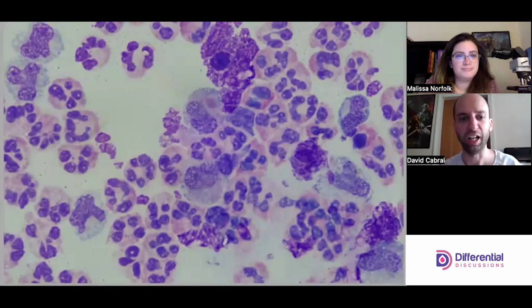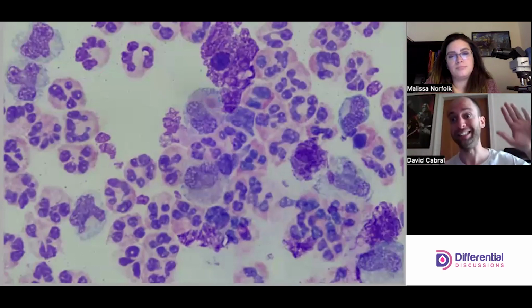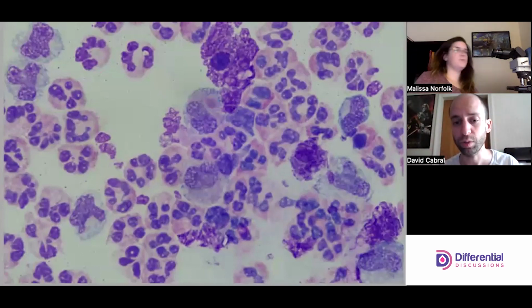So we would want to tell the clinician if we see crystals, so they would know, okay, is this a gout problem, or is this an infection problem, right? Infection is a medical emergency that may need surgical debridement, and it could endanger someone's life. The crystals are less pressing, I think, I'm not a doc, but we want to be able to give them that information and narrow down the differential diagnosis.